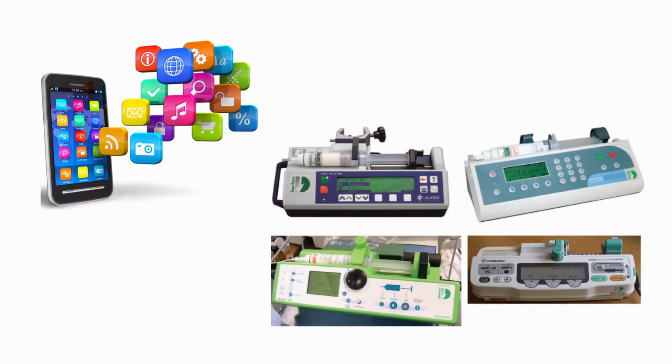Another way is to administer medications with the help of pharmacokinetic models, incorporated in an application, a simulator or a target-controlled infusion (TCI) system. In principle, it seems the ideal tool, since we can estimate the plasma levels and the effect of the drugs that we are infusing. However, the difficulty of this principle is that the drugs have a behavior when they are alone, and a very different one when they coincide with others simultaneously in the effect site. Although this pharmacokinetic form aims to establish a desired concentration, it ignores the pharmacodynamic interactions of the drugs: addition, synergy, or infra-addition.